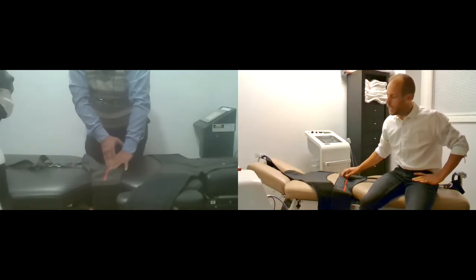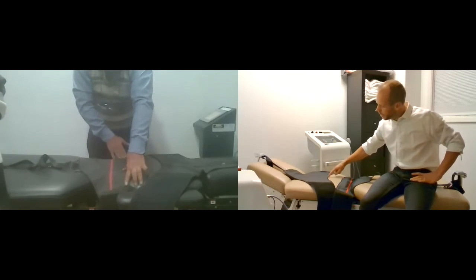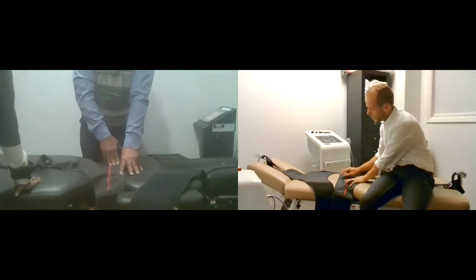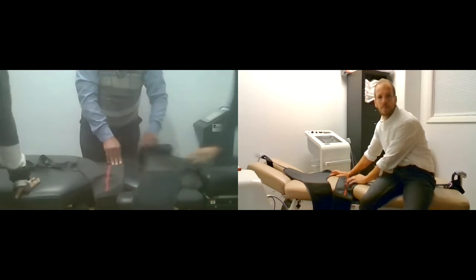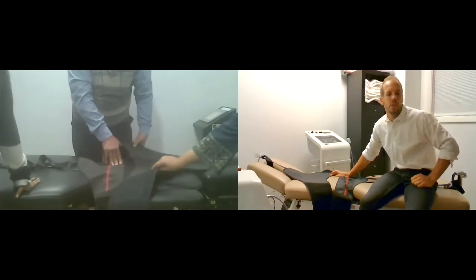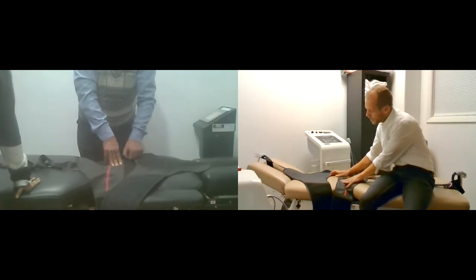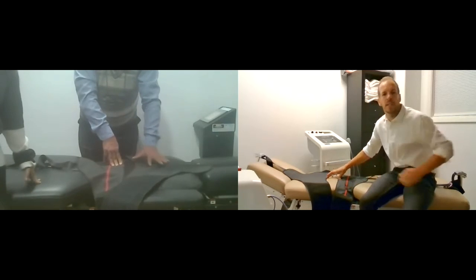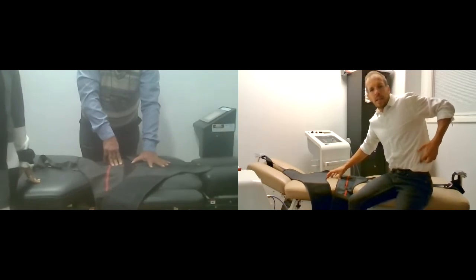And then on the thoracic harness, you see there's a red tab. So you have two red tabs here, this red tab and this red tab. Those two should be centered on each other, and the distance between these two is equal to the distance from the top of the iliac crest to the lowest rib.